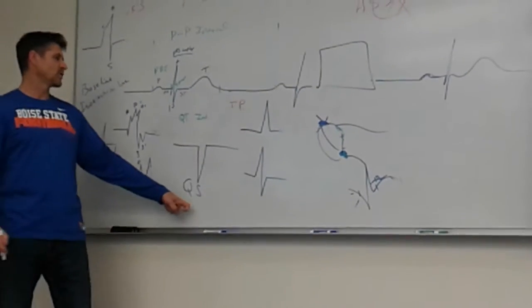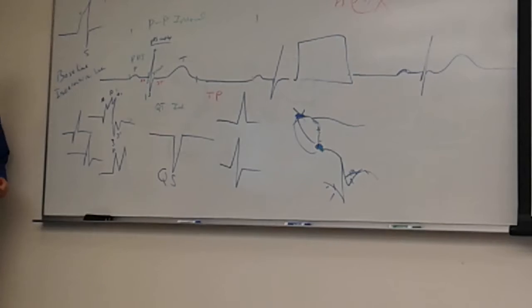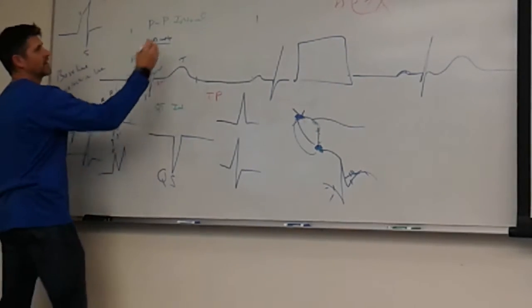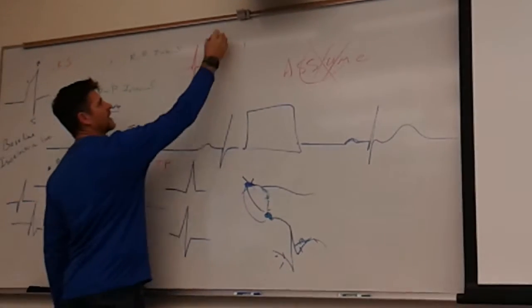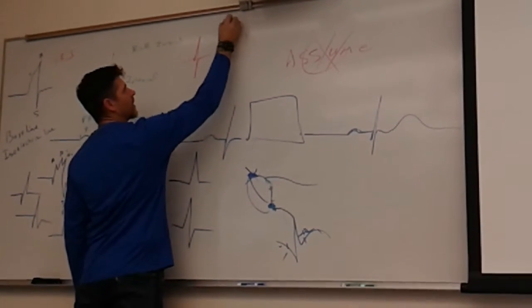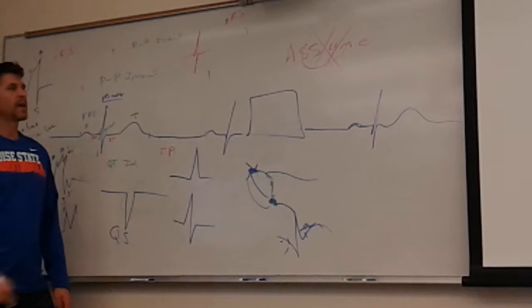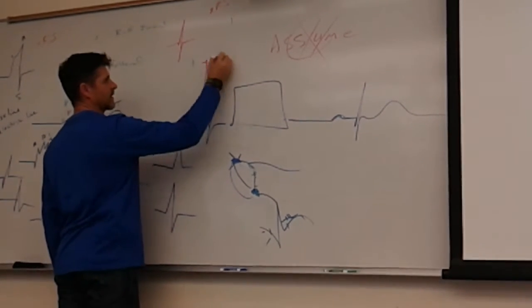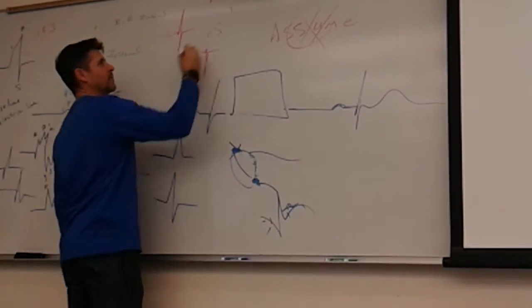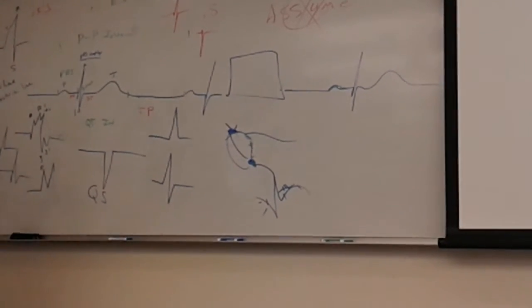This is capital Q, capital S. This right here would be a little q, big R, big S. This right here would be a little r, big S, okay, when we write it.